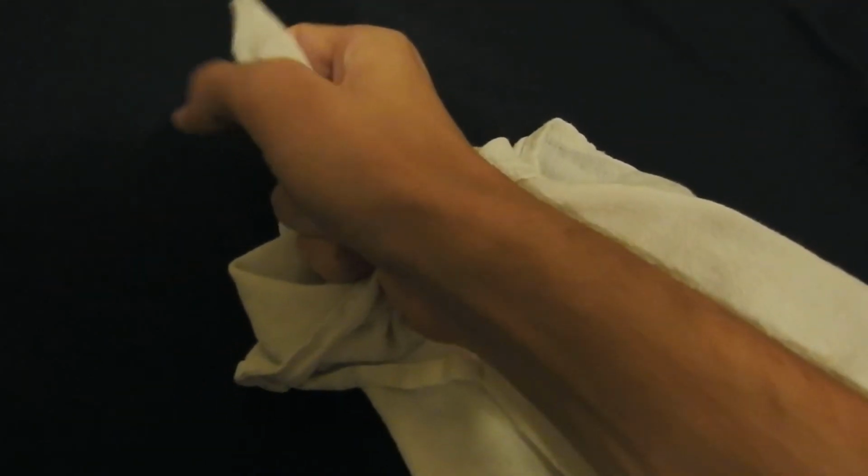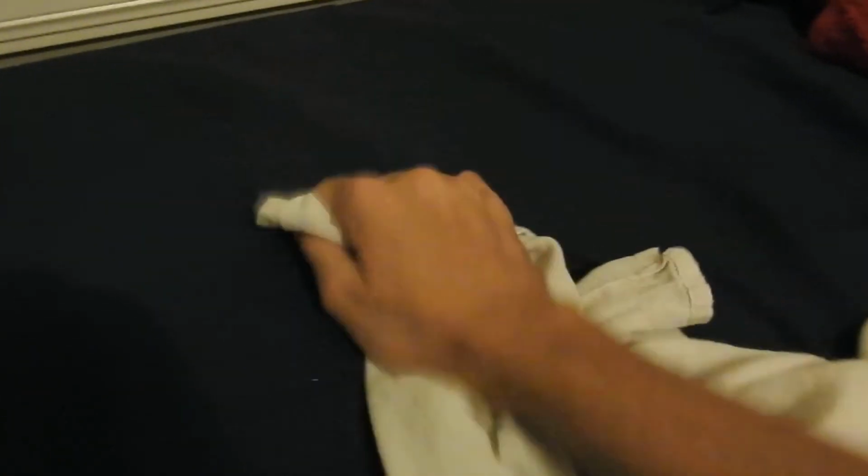Take, in this case, the towel, the triangular side, which can act as the triangular bandage, and if the person is conscious, ask if they can hold the arm, and make sure that the hand and wrist are slightly above the elbow in height, preferably about 4 inches up. Then keep it close to their chest, so that whenever you do apply it, it is a little bit easier.